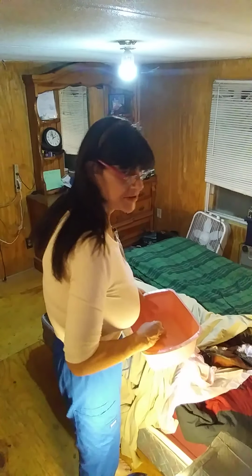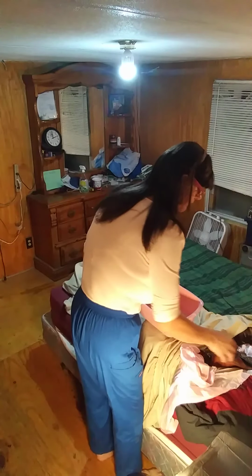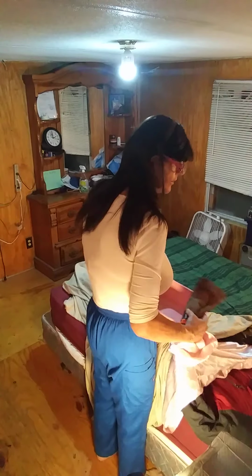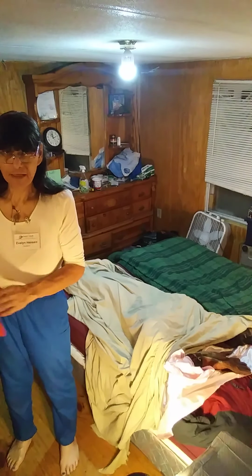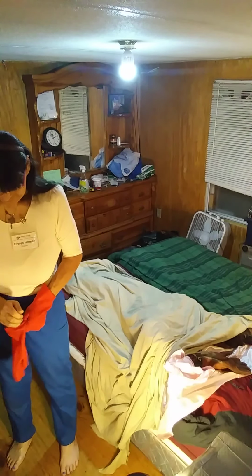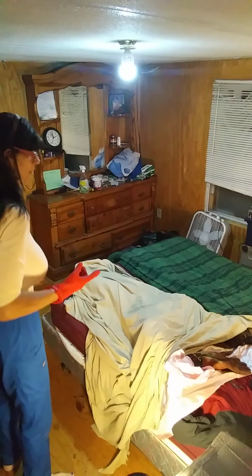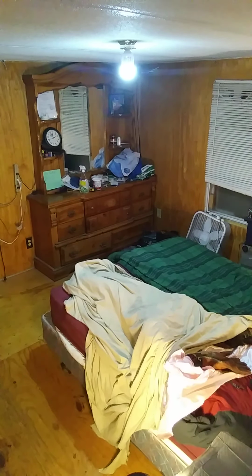And I'm going to ask Mrs. Cheswick to check it as well. Miss Cheswick, would you kindly check the water for me? I want you to be comfortable. Thank you, Mrs. Cheswick. Okay, at this time I'm going to put my gloves on. I'm going to raise the side rail. I'm going to put this bed rail up on this side. This way Mrs. Cheswick doesn't roll out of bed.